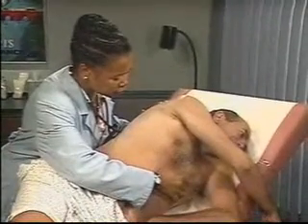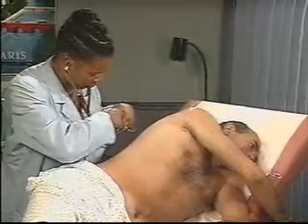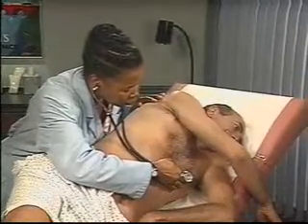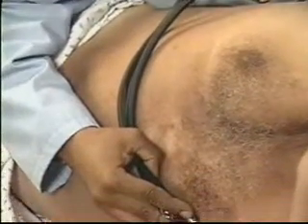To improve your ability to hear S3, S4, and the murmur of mitral stenosis, have the patient roll partway onto his left side, which brings the left ventricle closer to the chest wall. Then recheck the position of the apical impulse and place the bell lightly on it. If the patient had an audible S3, it would sound like this.